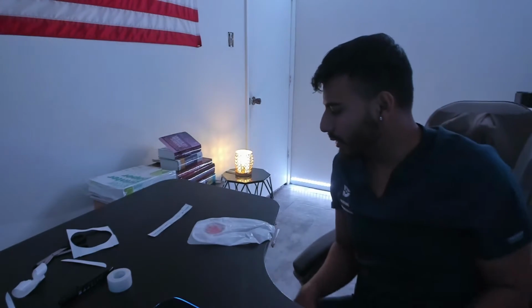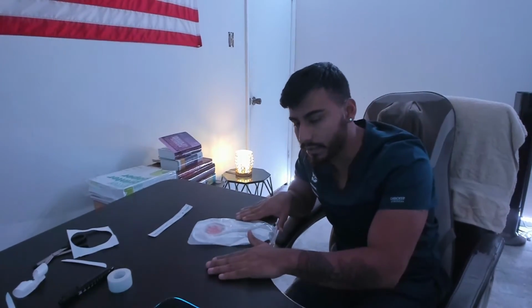Okay. So that, and then I would discard my gloves, perform hand hygiene, put the bed back to its lowest position, rail up, put the patient back in supine, semi-Fowler position, whatever the patient wanted. Assess for additional needs, call light within reach. My time of return, document the date, the time, and the assessment of the procedure. So that is how you place an ostomy bag.